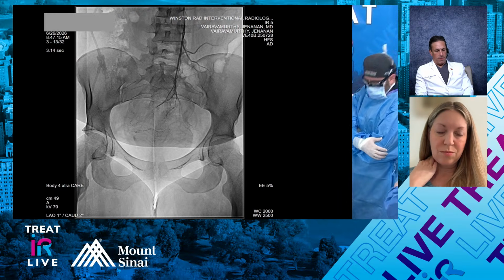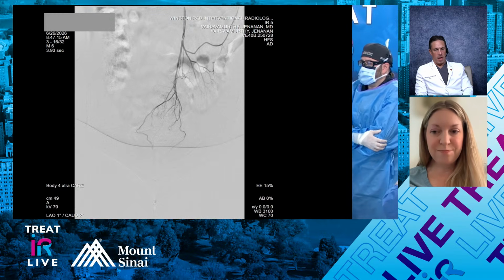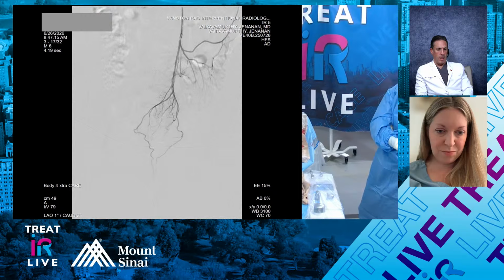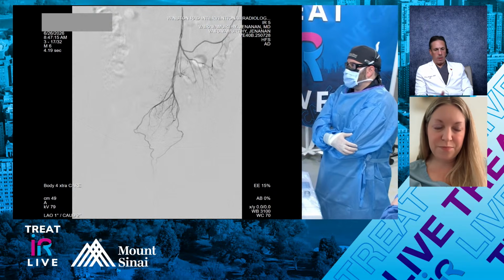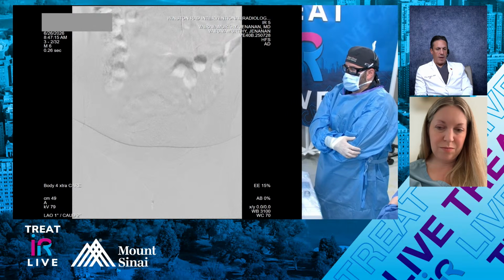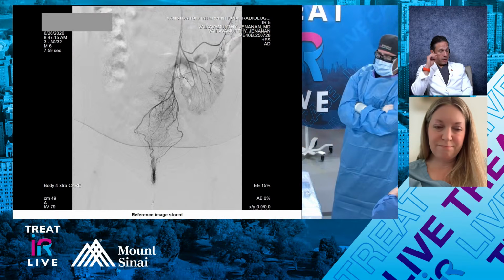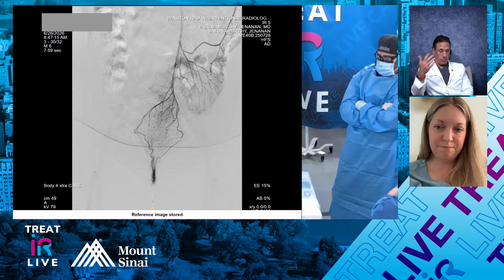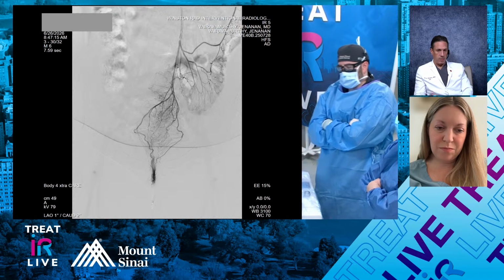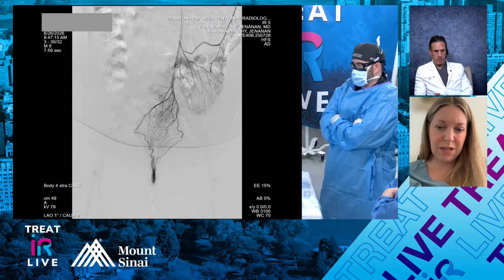Dan, if I was going to design an embolic material for this specific procedure, because obviously we haven't done that yet, I think we would have to understand exactly how distal we want it to go. So we're debating whether we use 500 or 700 or 900 micron size particle at the end. We have to have a liquid that has the ability to get exactly where we want it to go, not too far, and also not too proximal. And we know that coils are not going to occlude vessels as readily as a liquid. We've seen that in other vascular territories.